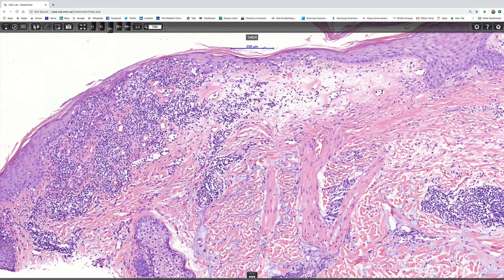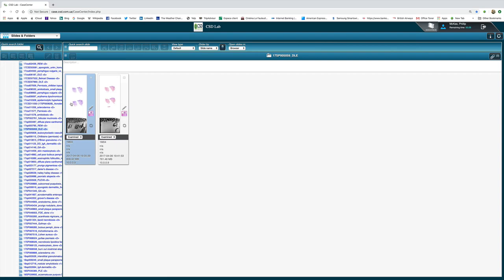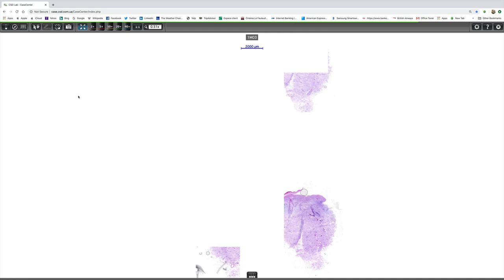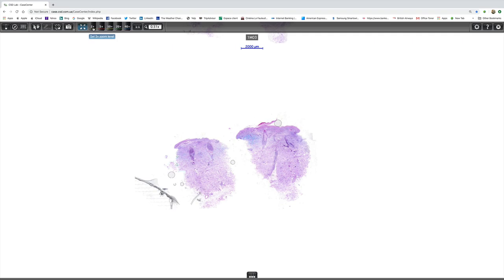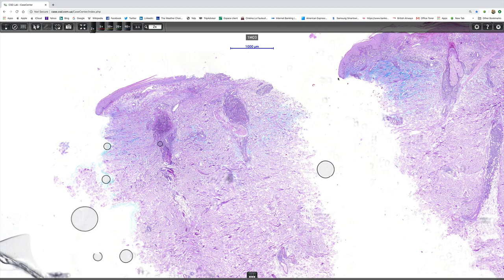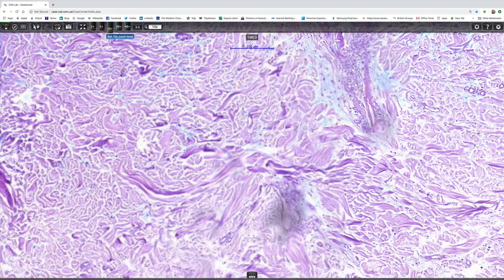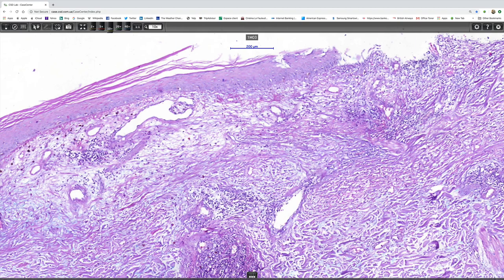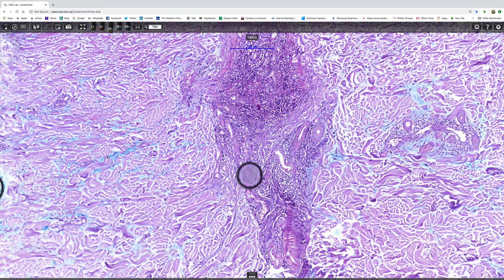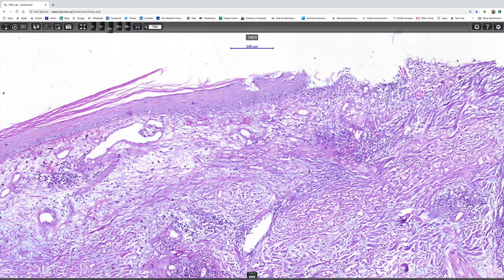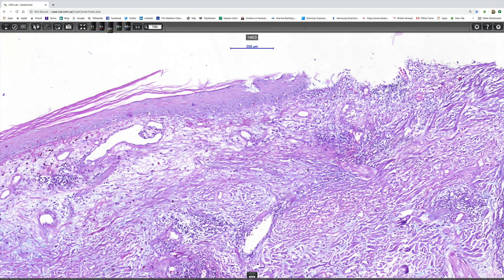The other thing I thought we'd have a look at is the Alcian blue stain, which is here. It very nicely highlights the mucin deposition. I thought there'd be more mucin in the superficial dermis, but when we go deeper, you can see there's lots and lots of mucin, which helps confirm a diagnosis of discoid lupus erythematosus.